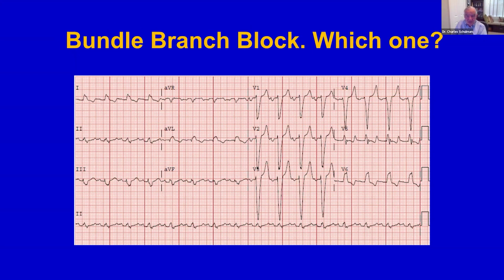Okay, here's another one. Bundle branch block, wide QRS complex. Which bundle is this one? Left. Correct. This is left bundle branch block.